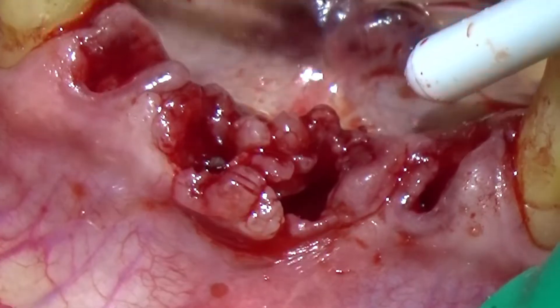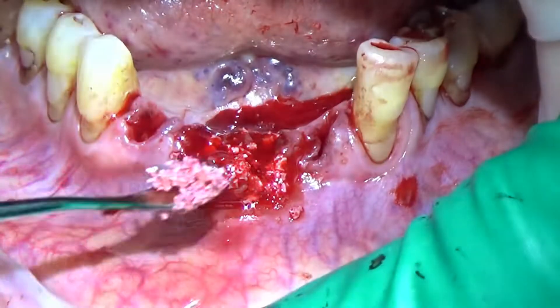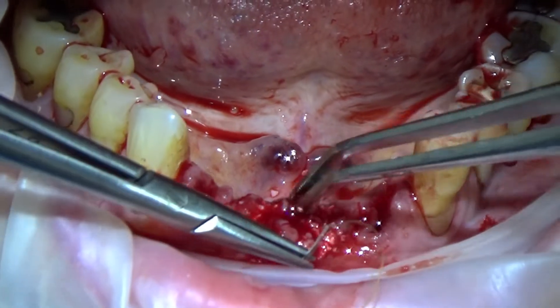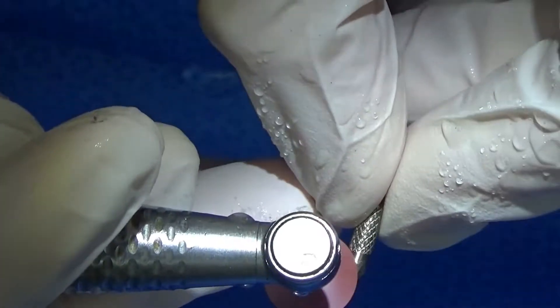The floss on the driver is to make sure the patient will just follow it, and then we'll pack some graft material in there. In this area I'm really trying to just keep tissue volume more than to do any major bone grafting, so I don't mind if no membrane is used here.